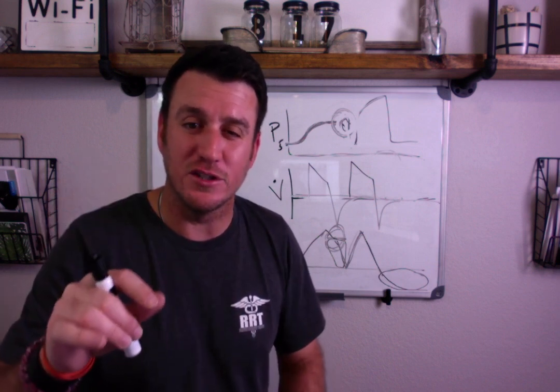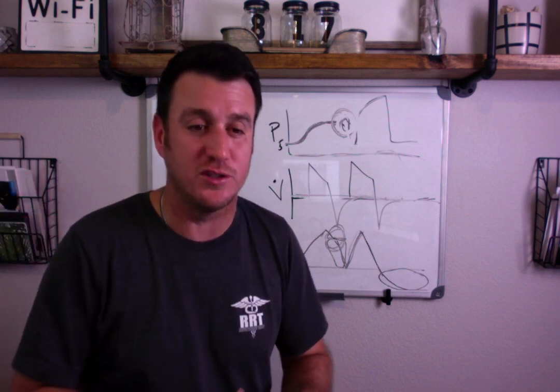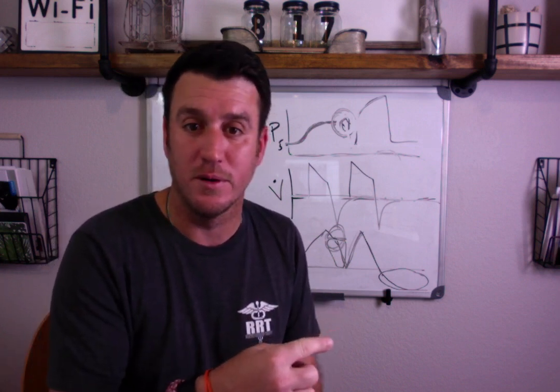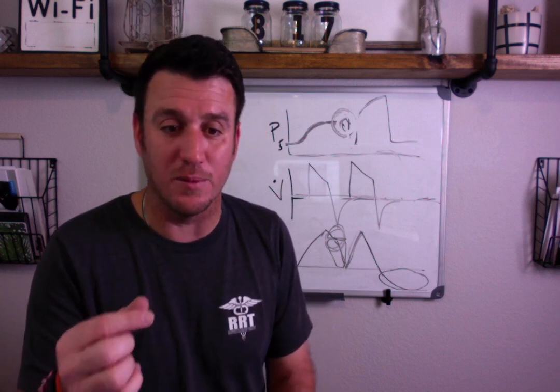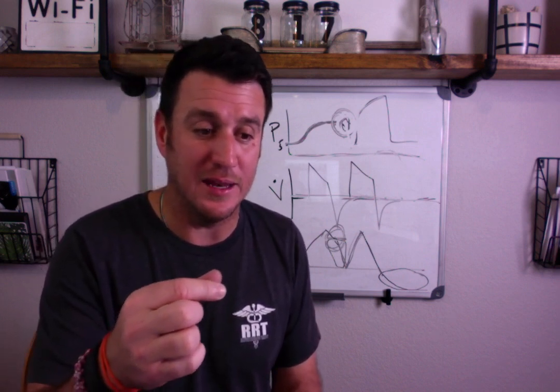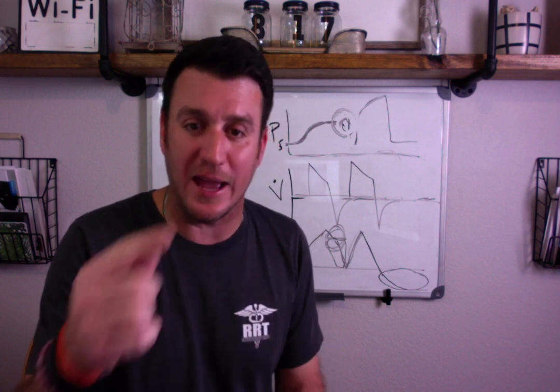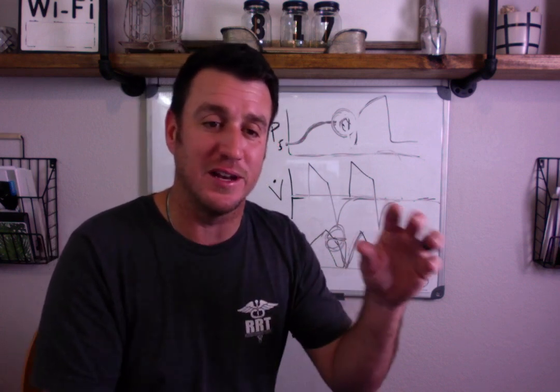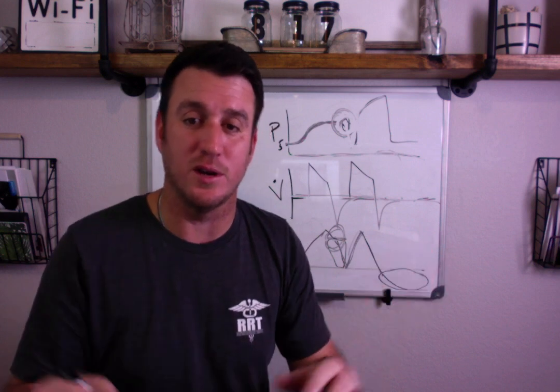Okay, you should never just adjust alarms just to be adjusting alarms so they don't alarm. If the vent alarms that you have set are set correctly, then if you have to adjust them, you should ask yourself, is there anything else I can do to make the ventilator breathe more like the patient wants?